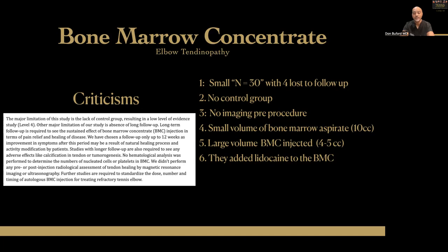So we can use lidocaine at the skin, especially if we're going into a joint. If we're doing something that's extra articular, like tennis elbow or golfer's elbow or the ulnar collateral ligament, I prefer to just use ethyl chloride and use a 25 gauge needle. I haven't lost a single patient doing it that way. They don't even use profanity most of the time.